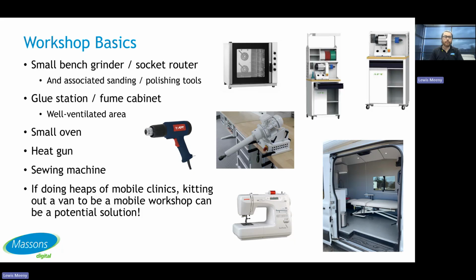One thing I have seen done before, especially if there's a lot of mobile clinics, get out a van, especially if you're doing this for the first time. If you can fit a little workshop in or a little clinic and you can cart that around, it can be a really, really good way to move things around without having to worry about picking it all up and setting it all up each time.